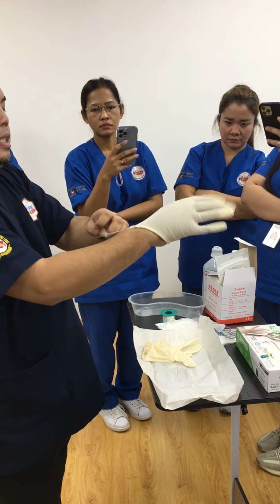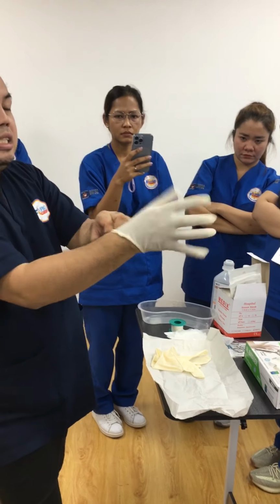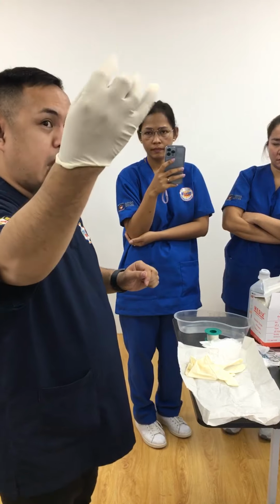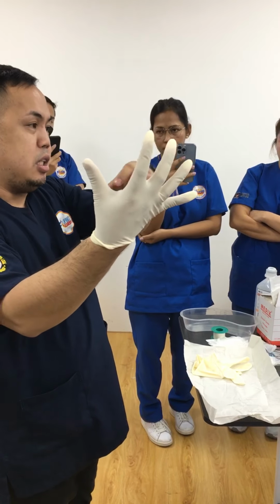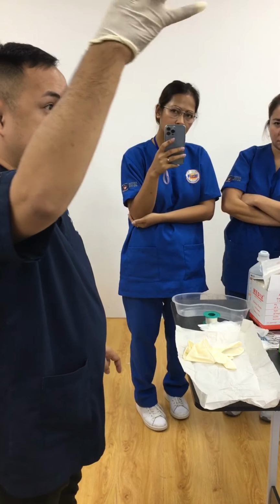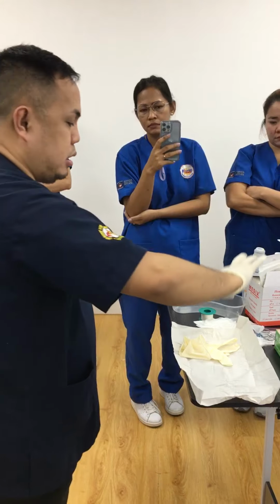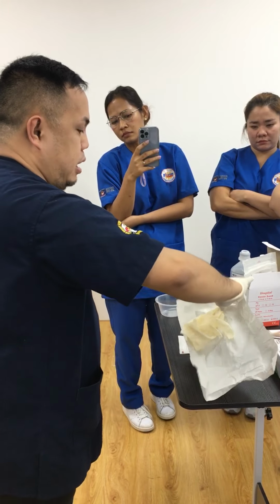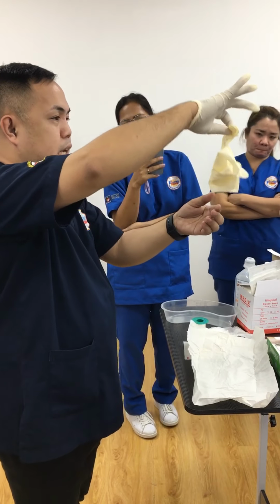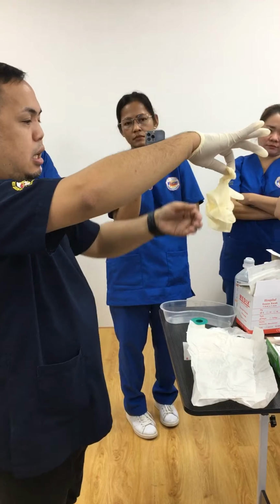So, what if it's not fixed yet? I'll just leave it like that. Then I will fix it later. So, now, the surgical glove is already inserted in one hand. So I can now touch, because this is already sterile. My hand is already sterile with the glove. So I can now touch the sterile part of the glove, which is the outer part. Then I can hold it. Sterile plus sterile is equals to sterile, right? I'm not breaking any concept.